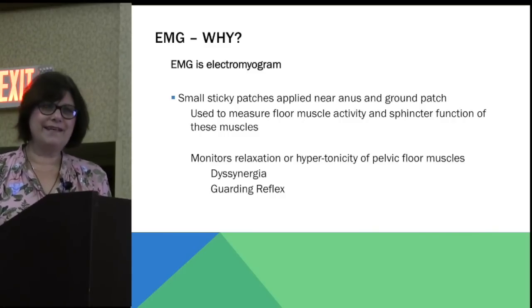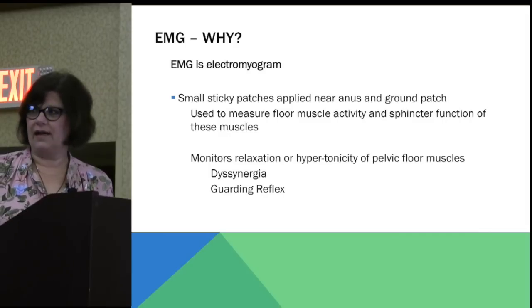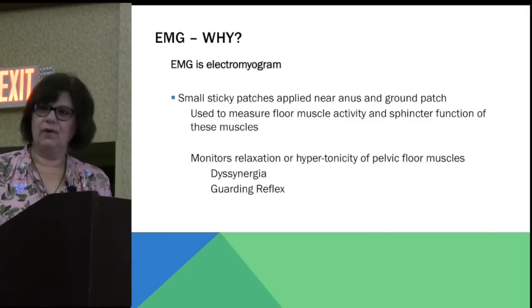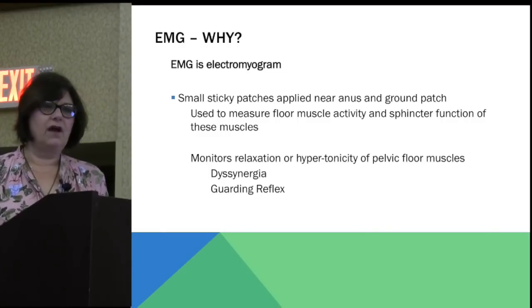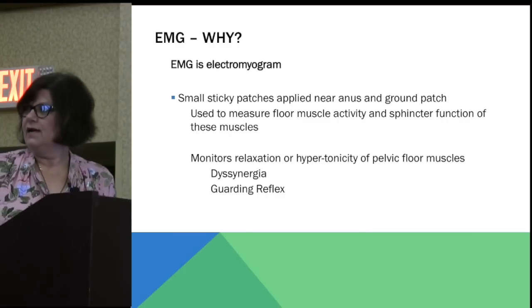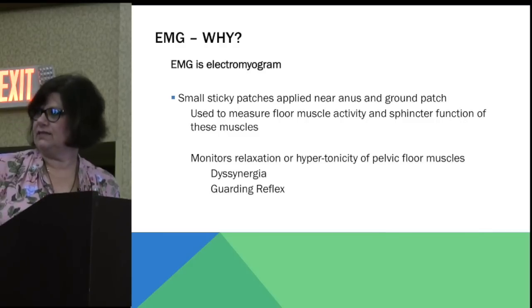Again, this tells us, are the pelvic floor muscles really tight? Are they not allowing the body to empty properly? And that's a big issue, or it's one of the things you look for in urodynamics. Again, it's where you see kind of that intermittent voiding pattern. These people are great candidates for pelvic floor therapy. So there's a lot of components here that you can look at and refer patients off for different treatments by looking at the EMG itself.